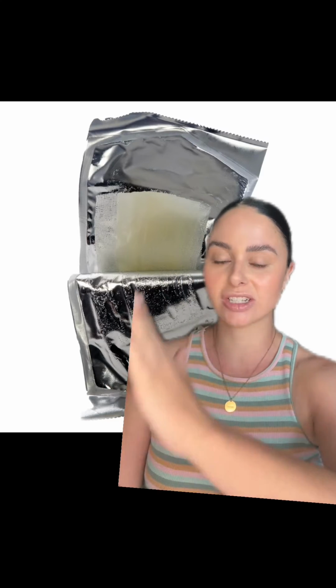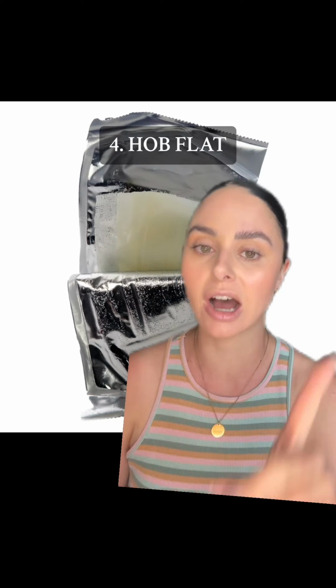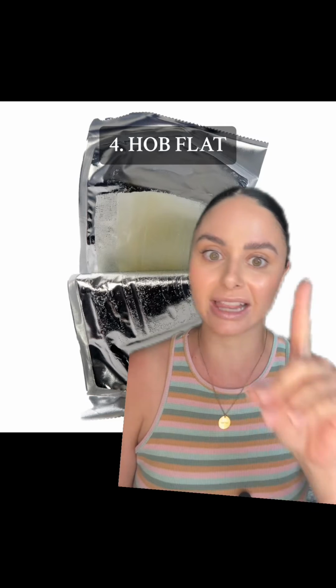You're going to want to make sure your patient's head of the bed is flat. And if they're not able to follow this and lay flat for up to an hour after you remove the line, definitely coordinate with your provider to see if there's something you can do medication wise, or if we can do something to keep the patient calm.